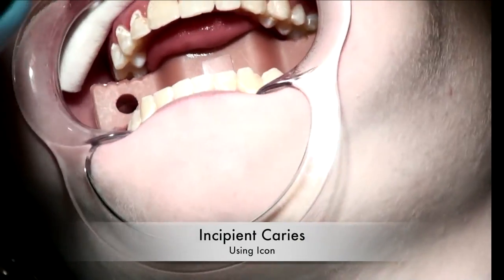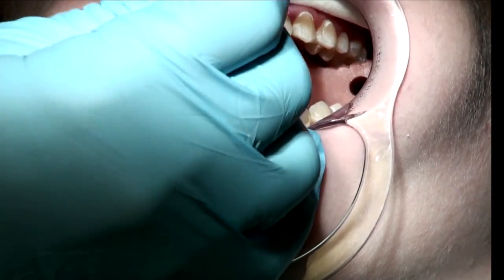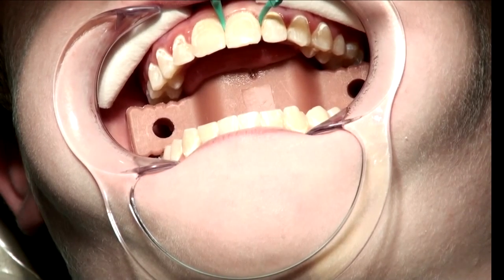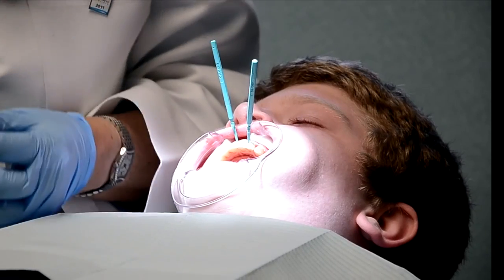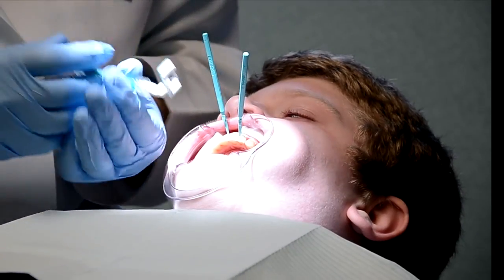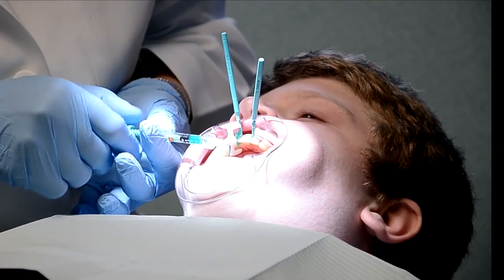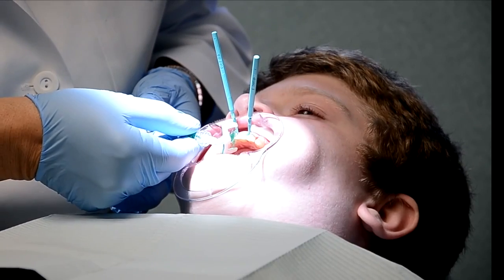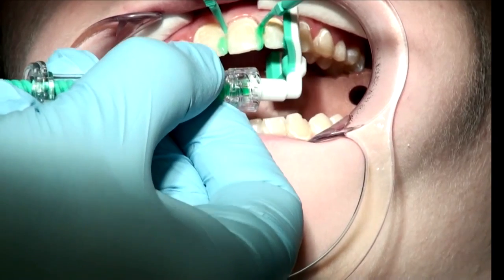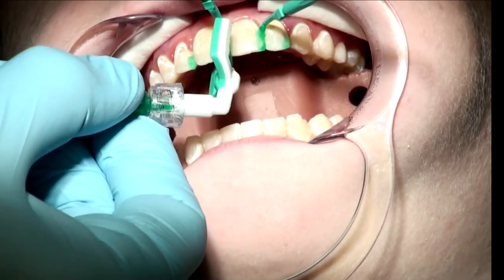All right Jason, the first thing we're going to do is place some wedges between your teeth. These are custom wedges that have been designed by Icon, and they're used to separate your teeth ever so slightly. The second thing we're going to do is take 15% hydrochloric acid, which is an etch solution. This etch solution is going to be placed interproximally with a special delivery system. Prior to starting Jason's procedure, we've painted some clear rubber dam on. This etch solution opens up the pores of the teeth to allow capillary action of Icon to infiltrate into the incipient caries.